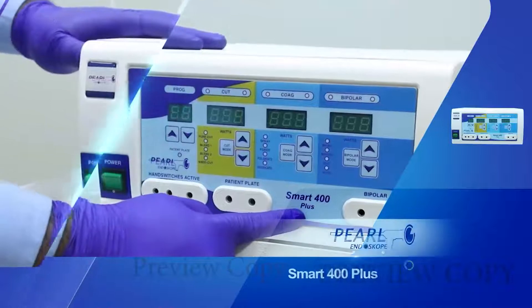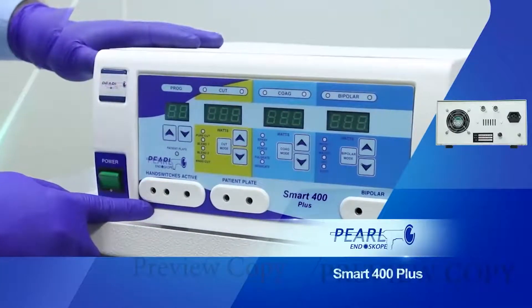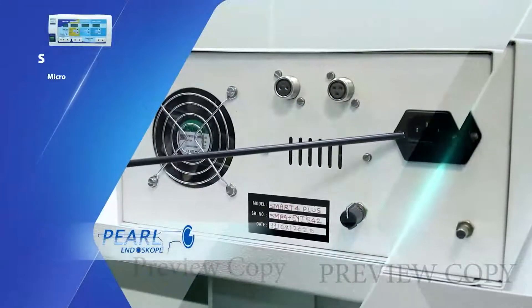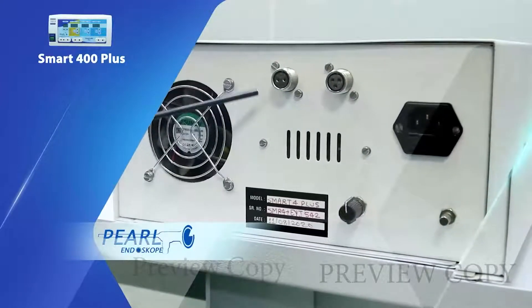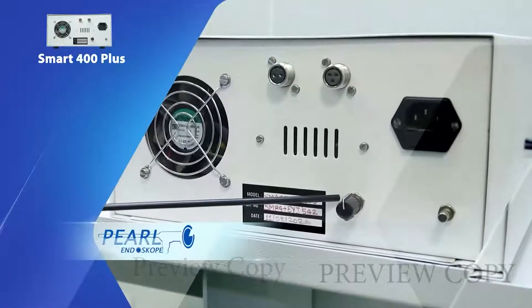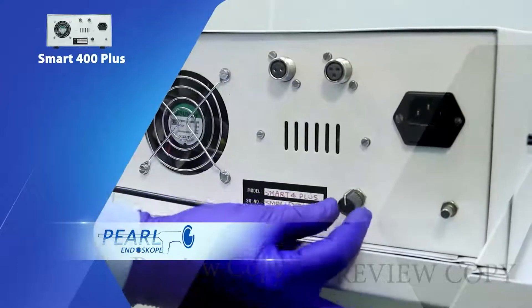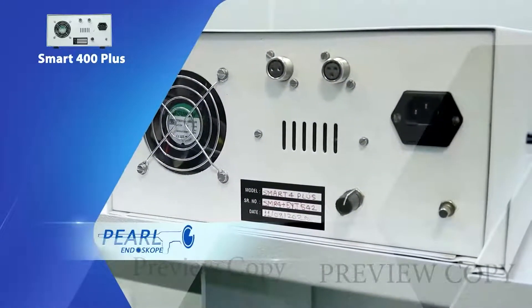This is a demonstration for the Smart 400 Plus. This is the power cable connector, the monopolar foot switch connector, the bipolar foot switch connector. This is the machine activation volume control switch; it can be adjusted clockwise. This is the exhaust fan.